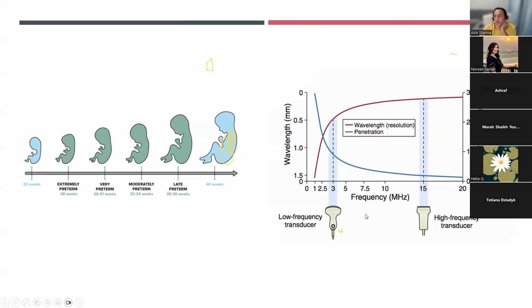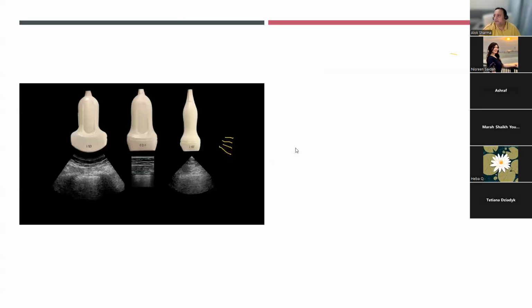So actually, if I've got a long linear probe, which gives me a decent, really long footprint, my linear probe means that I can see everything within one perpendicular image. And I can see R1, R2 anteriorly, R3, R4 laterally, and R5, R6 at the back. And it's just 3 images that I have to take to be able to see the whole of the lung architecture. So again, that's quite important, and physics has quite an important role to play in how we then want to select our probes.